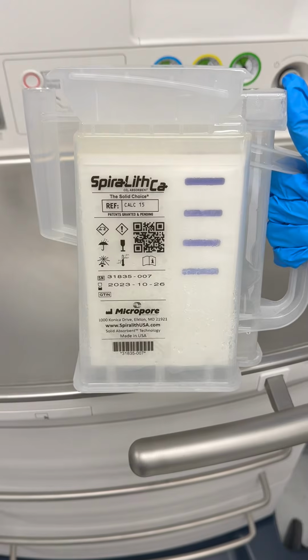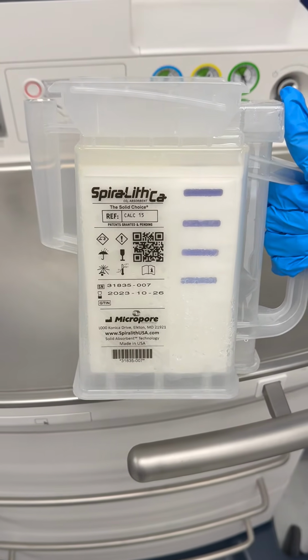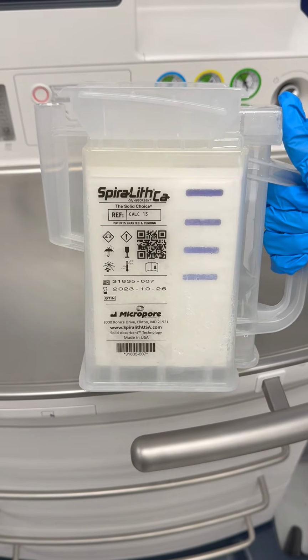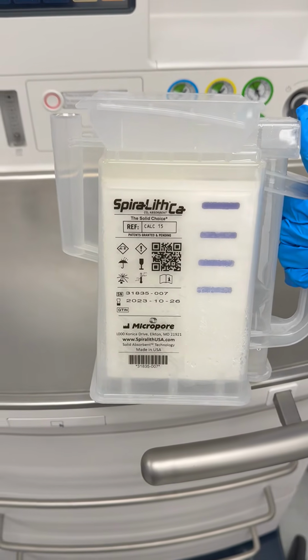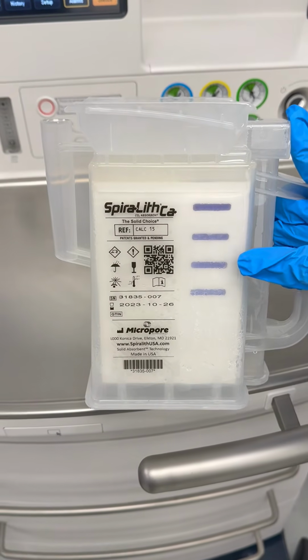Although the indicator windows are used to anticipate end of cartridge life, capnography should be used to determine when the actual change should be made. Typically, CO2 absorbent canisters are changed at a FiCO2 of 0.5%, however, this is a clinical decision and may vary. Typically, the third window will be reacted at this point.